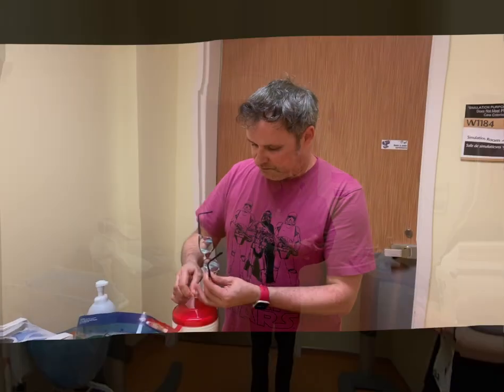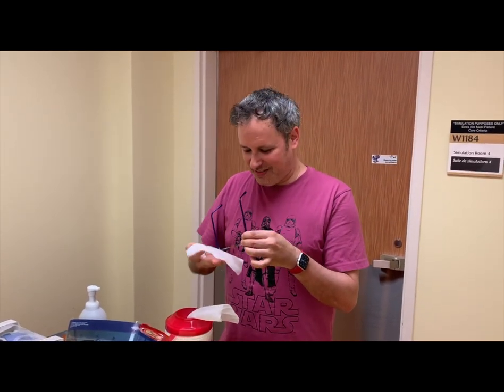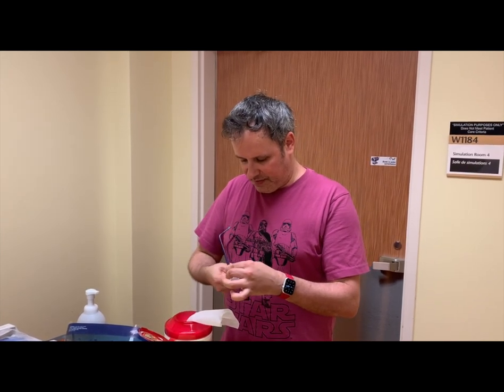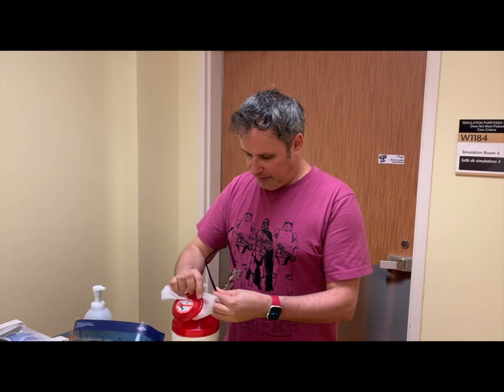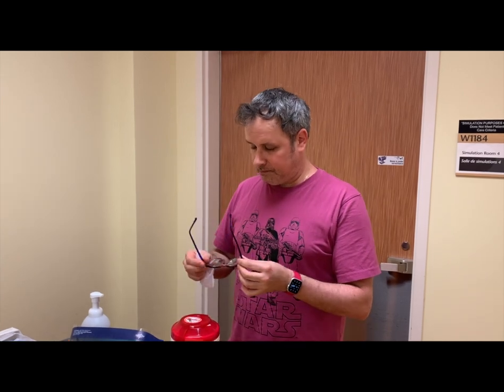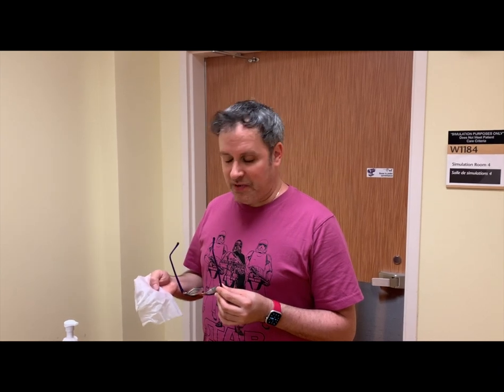Stay safe out there. I'm going to use a disinfectant wipe to clean my glasses now because I dropped them while doffing. Wipe every surface and let them dry. You could also get away with just soap and water — do a good job with soap and water, or use a disinfectant wipe. I also like to use a disinfectant wipe on my phone at the end of every day. So you have options.